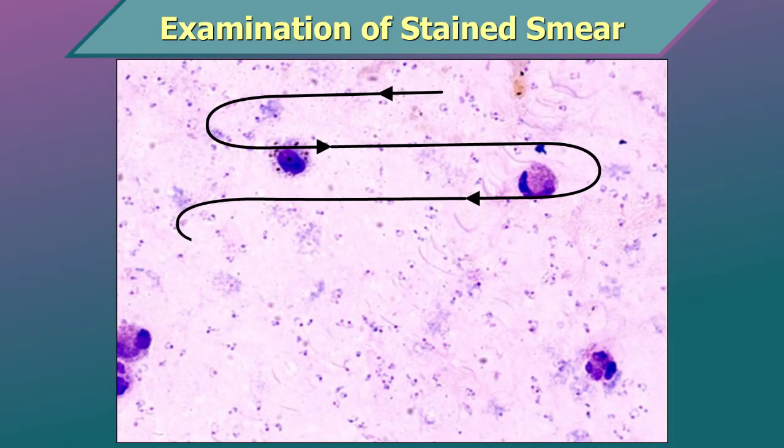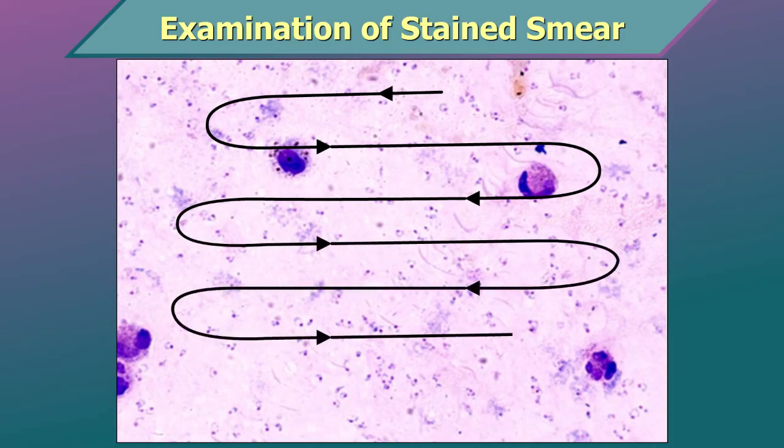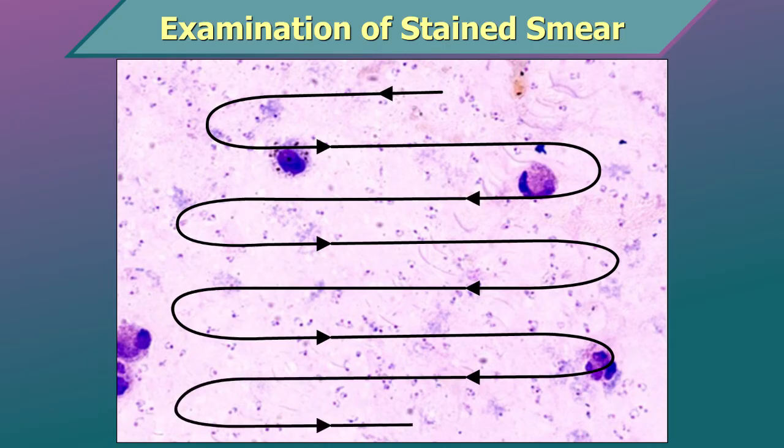Then, moving the slide inwards by one field, returning in a lateral movement and so on. An area where 10 to 20 WBCs per field are seen in a thick smear is ideal for parasite detection. Examine a minimum of 100 fields in a thick film before declaring it negative.